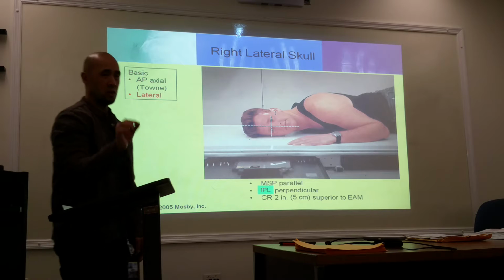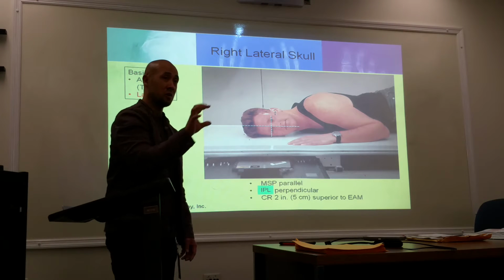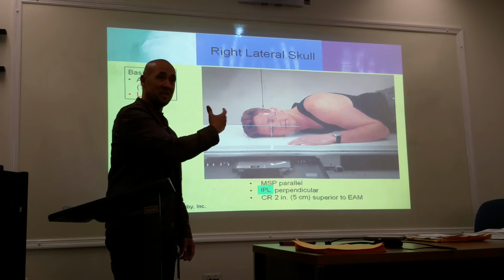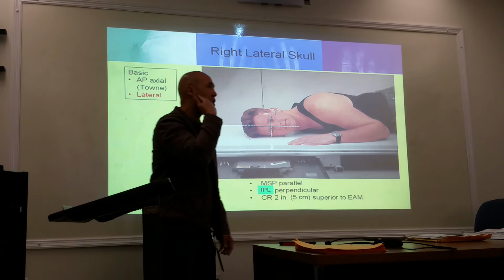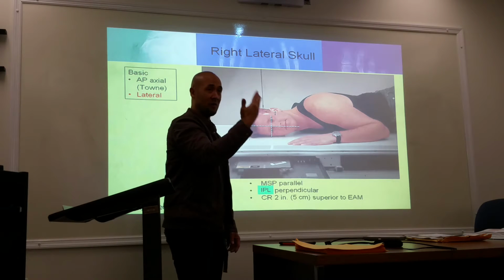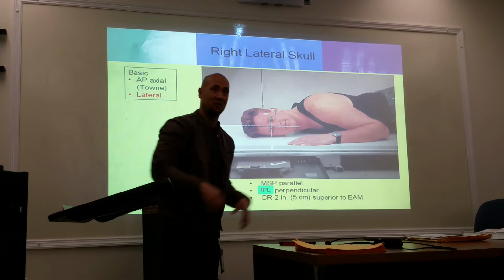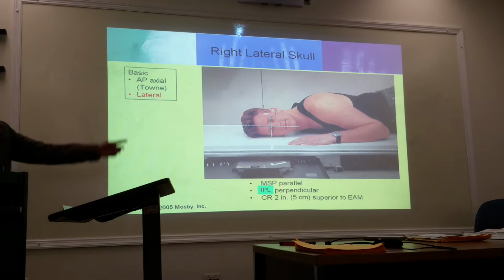Oh, okay. So the whole BB is just trying to mark the general area, so the doctors know where to focus when they see that BB. It's like a pinpoint. They say, it hurts here, then they'll put the BB around that area. So when they look at it radiographically, they know what specific area to focus on. Okay. That's what you meant. All right, any questions here?